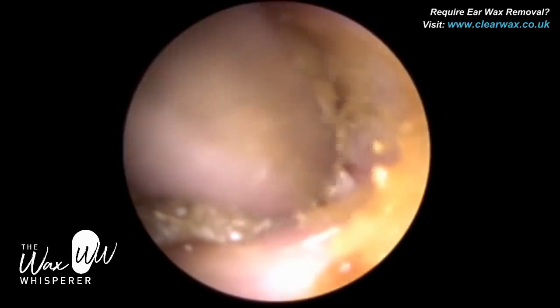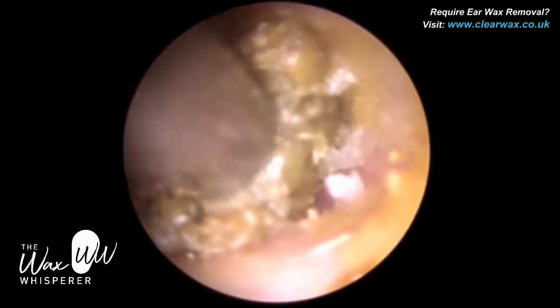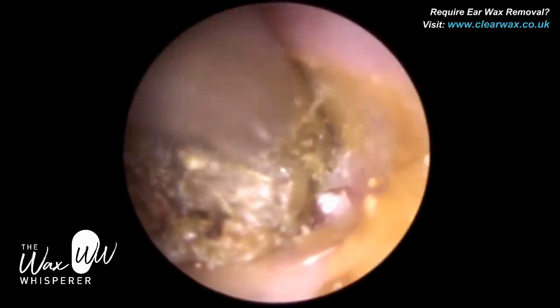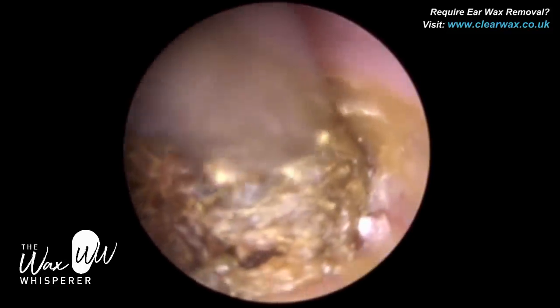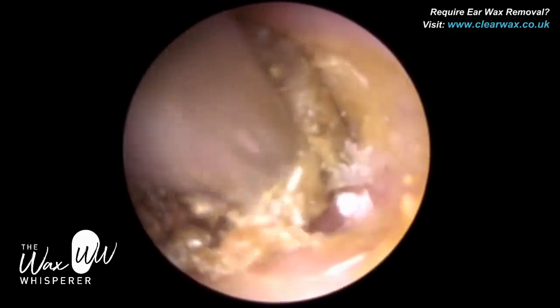We're probably mid-canal, and this is the base of the ear canal. You can see the drops have softened the wax here but it's not done much else. I'm now just on the posterior canal wall, and you'll see me doing this for the next few minutes — just trying to loosen this plug.